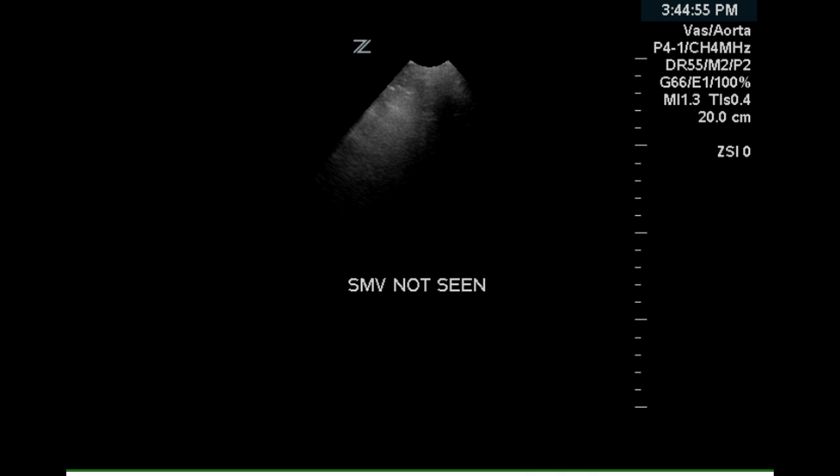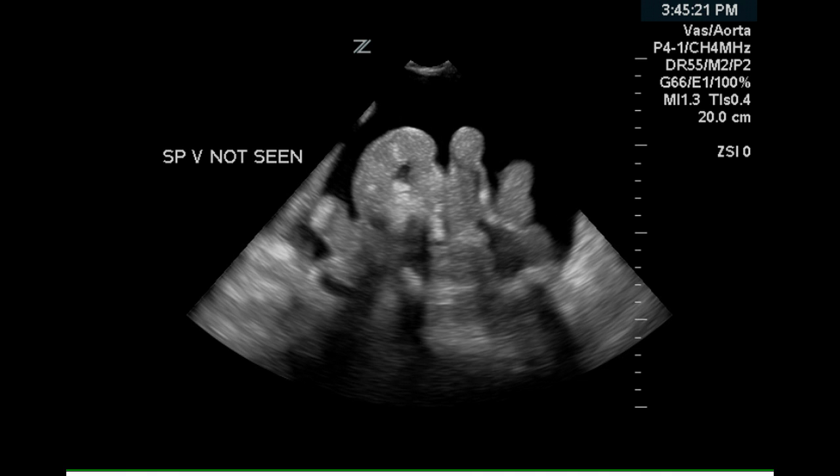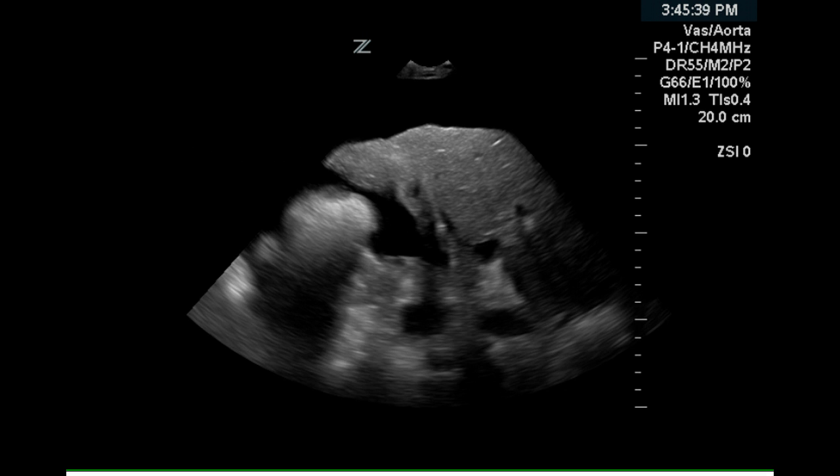The superior mesenteric vein was not visualized due to overlying bowel gas. Floating loops of bowel can be seen below the level of the liver, indicating moderate to marked ascites.